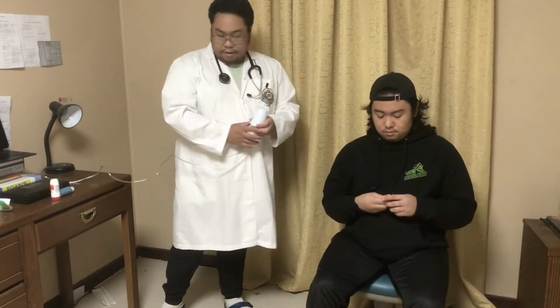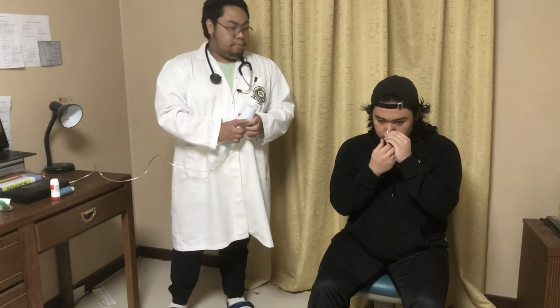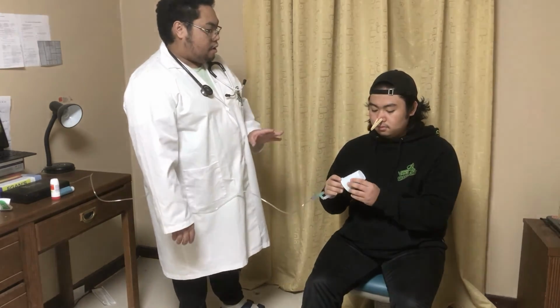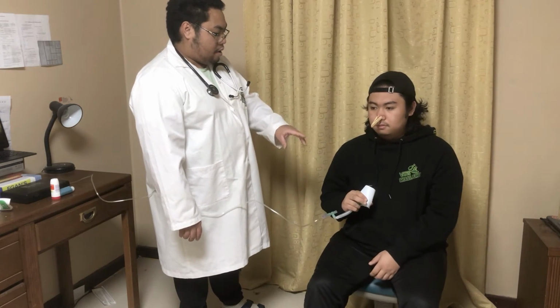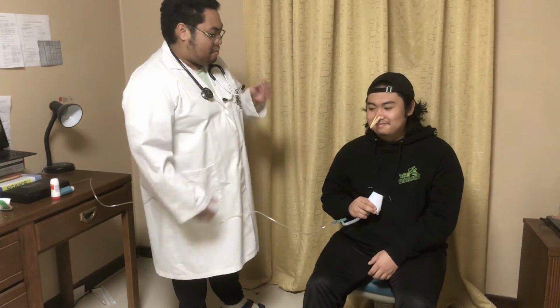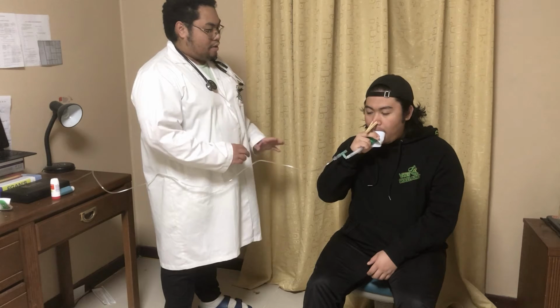So make sure to put your nose clip first. Now we're going to be starting with the test. Here you go, sir. First, make sure that it's tight. It's the lip sealed tight inside your mouth. So can you kindly put it in, sir? Now. Okay, so let's start.